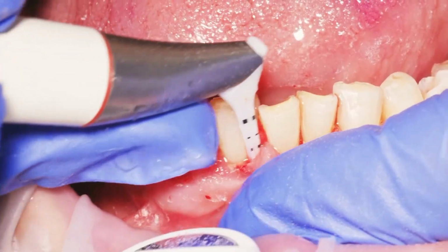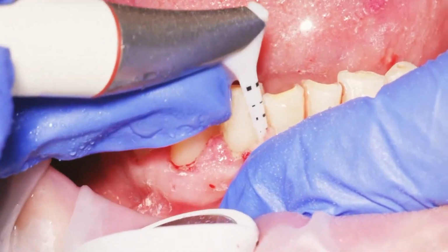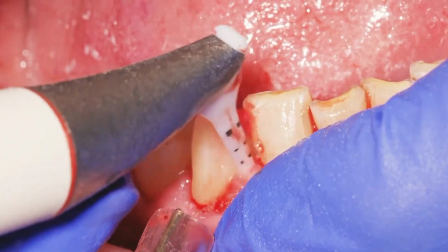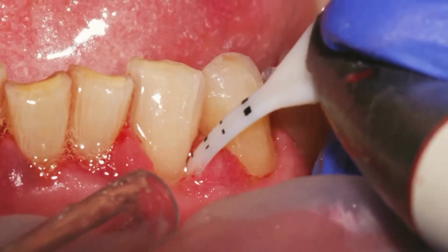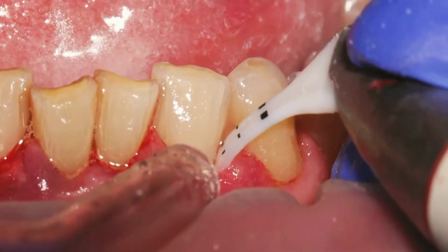And when you activate the pedal and the power, you need to stay at 50, 60, 70% of power with 80, 100% of water.